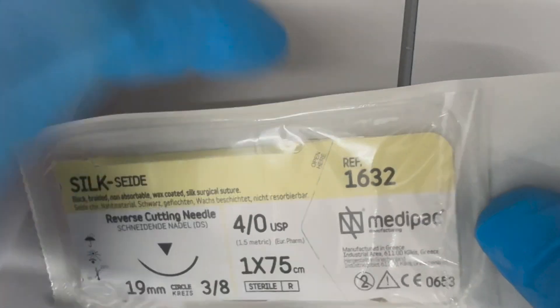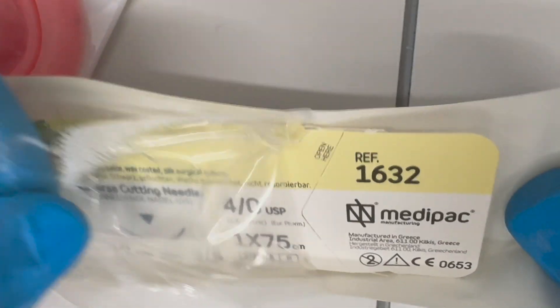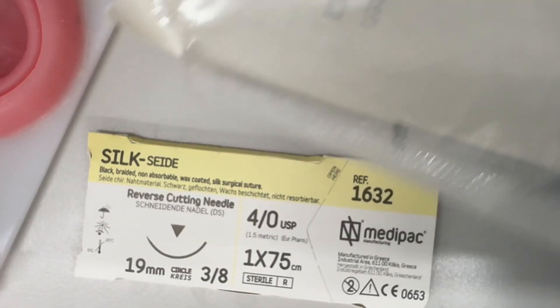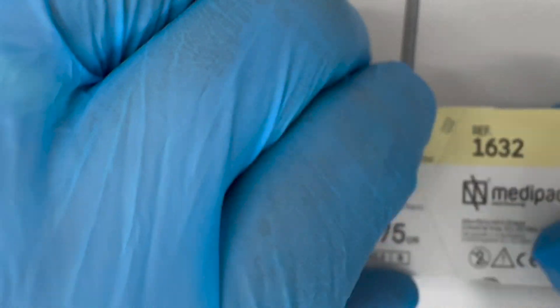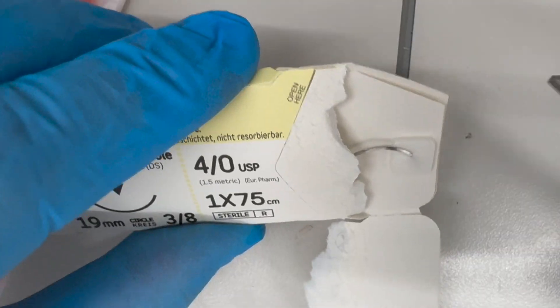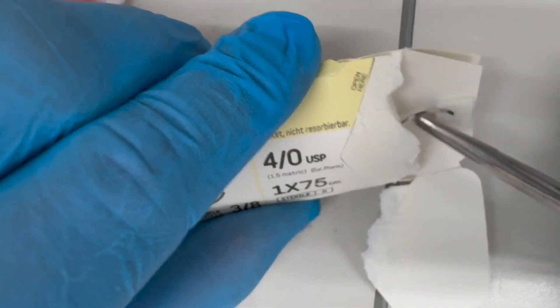The first thing would be to open the package. Someone would usually open it for you because it's sterile. This part is sterile and will be dropped onto your surgical field. If I open this first part here, I will find the needle and I can pull the needle out using the needle holder.